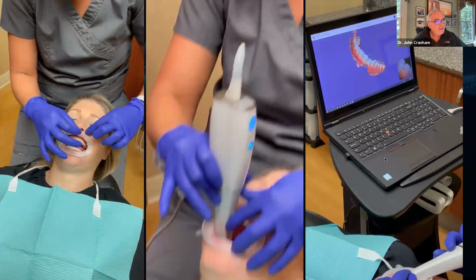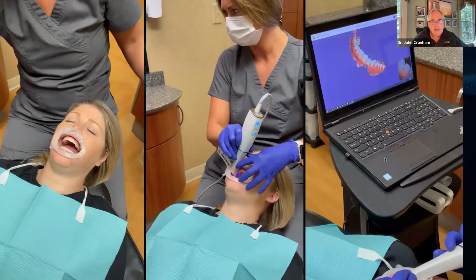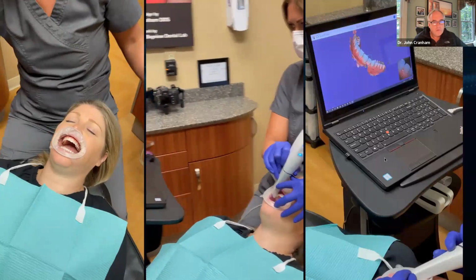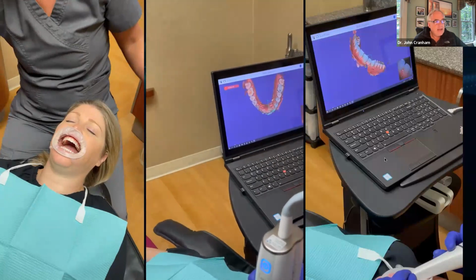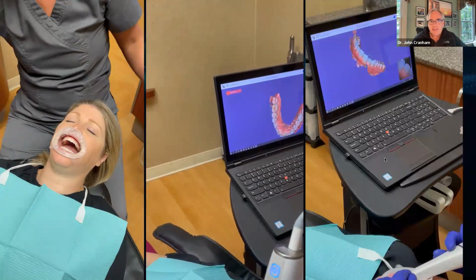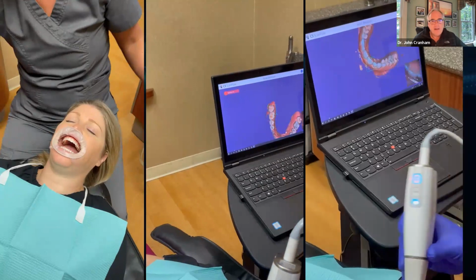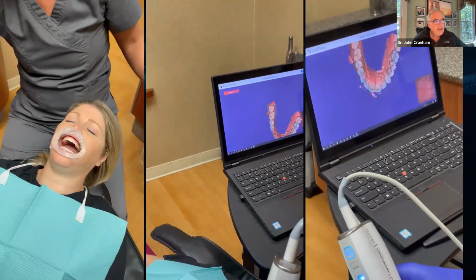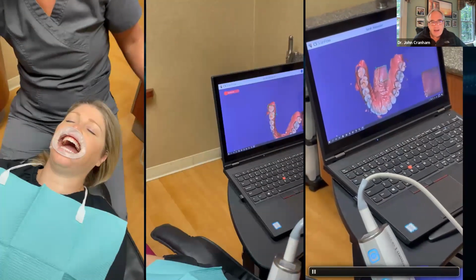And then once you start scanning, again, keeping your eyes, getting your assistants to keep their eyes on the screen and rolling the way the manufacturer recommends is good. And then what I would also say is a lot of the companies are pushing for getting the fastest scan they can. Take a little bit more, another 30 seconds, and get all the data. Make sure you get the free gingival margin and you get the palate and you get all the things that you need. Because if you start doing wax ups or doing things to this, you may need that data.